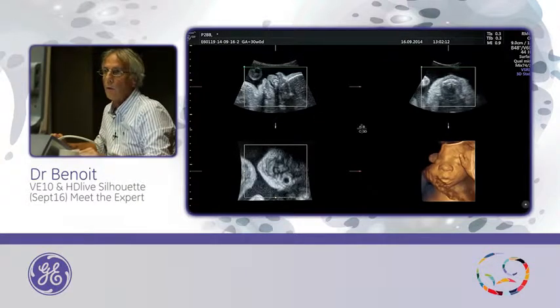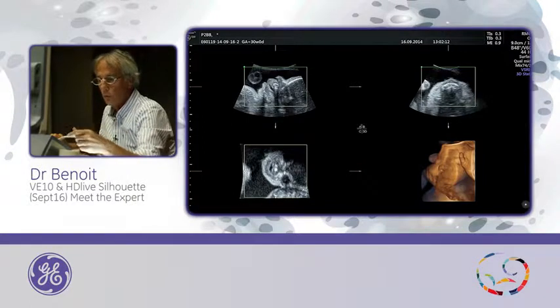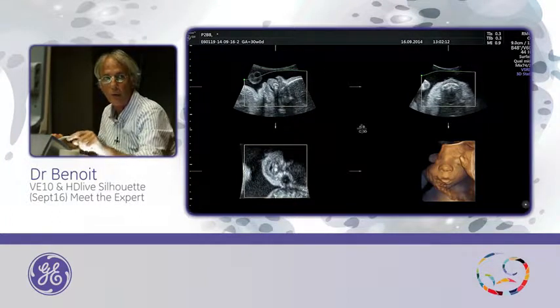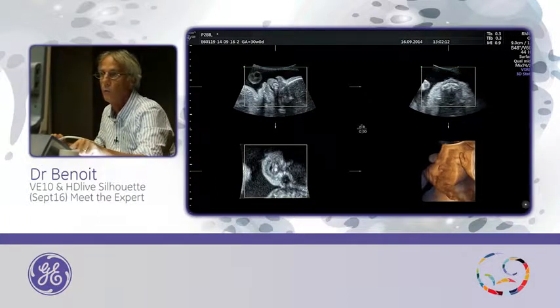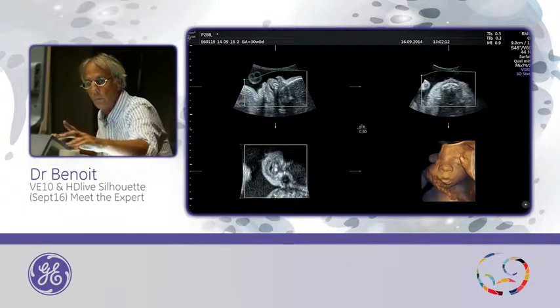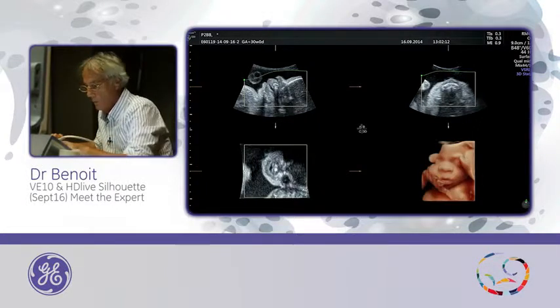And if something is in front of the face, you can use magic cut, you can move the position of the box, but also you can use sono render start. And when you use sono render start, the computer will find exactly where to put this green line. This is without sono render start, and this is with sono render start.